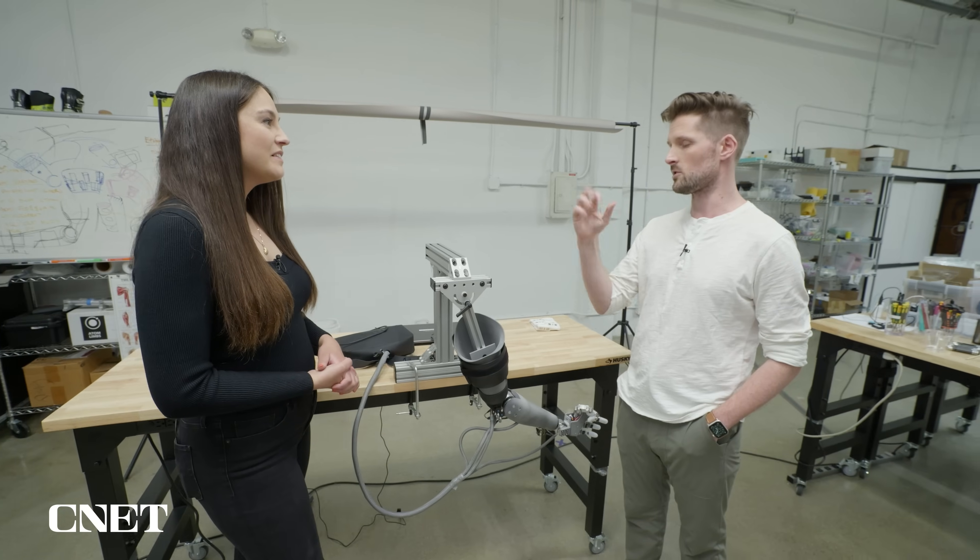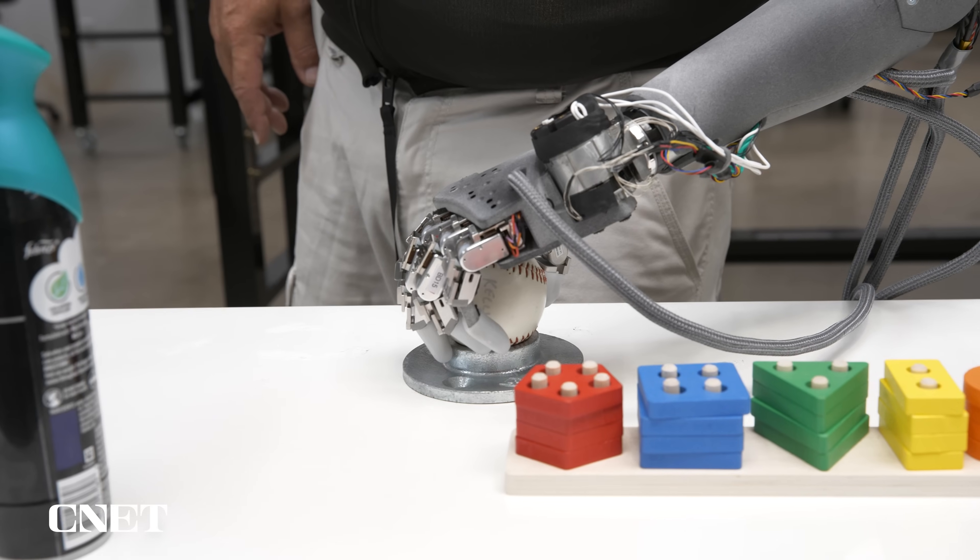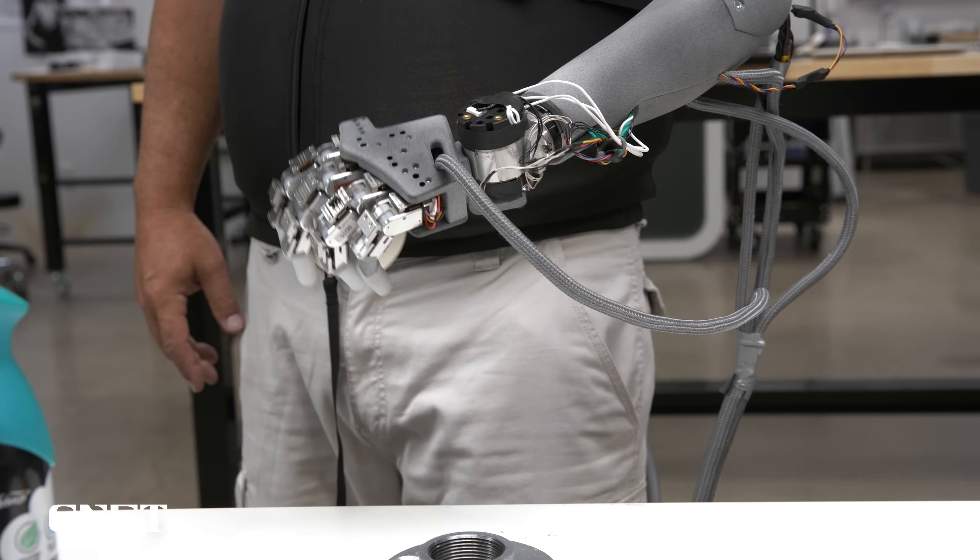Elbow, wrist, fingers. Open and close the hand. You can get touch feedback on the fingers. You can lock the grip so you can maintain grip on something. You can auto-level with the hand so that it won't spill your wine or your coffee, whatever it might be.